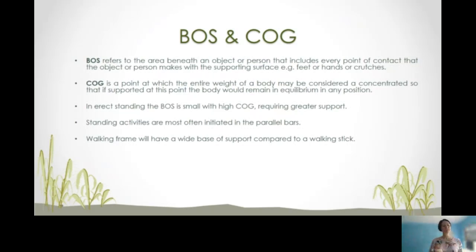Now with mobility aids, let's consider if you issue crutches, then you have a similar 4-point base of support as compared to being on all fours with rehabilitation.